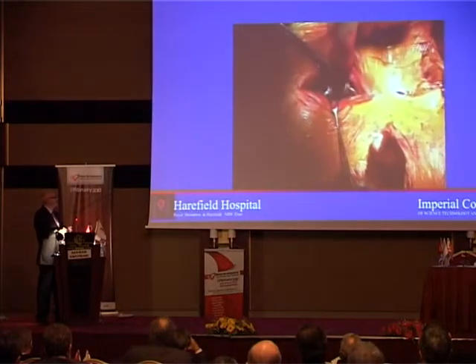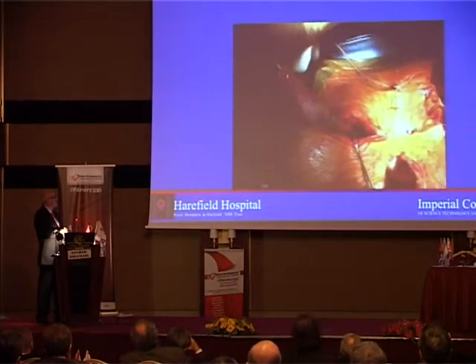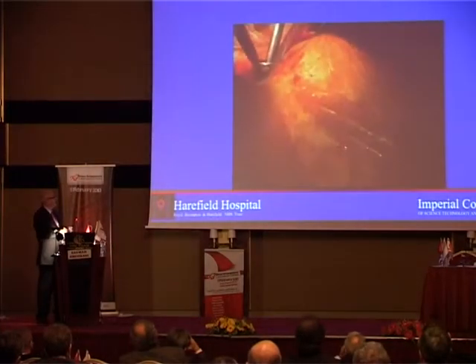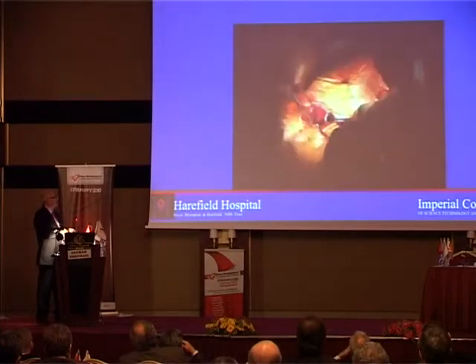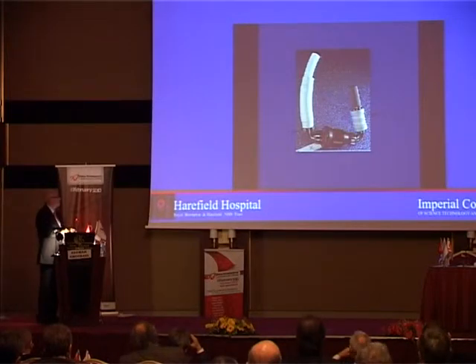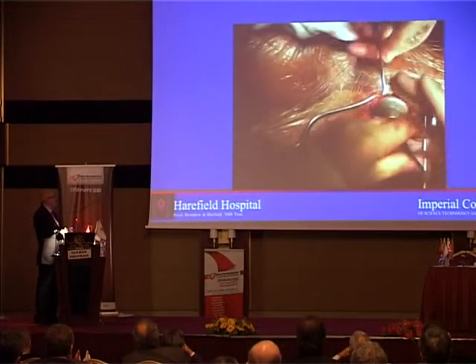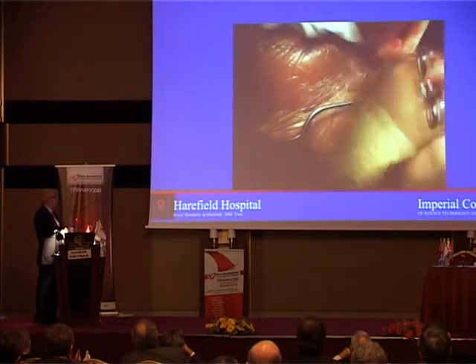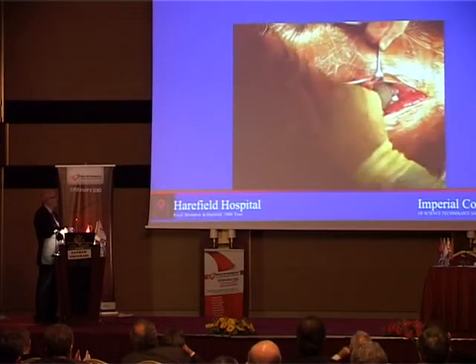Another incision going to the lower part, and the device is there. And this is the cannula pulled out. You don't have to dissect it, it's pulled out also in that hole. And then we remove the body of the device with that small incision. The drive line is cut, the white part is the drive line, and the device body is pulled out through the same hole.